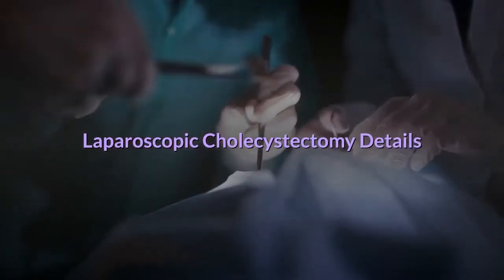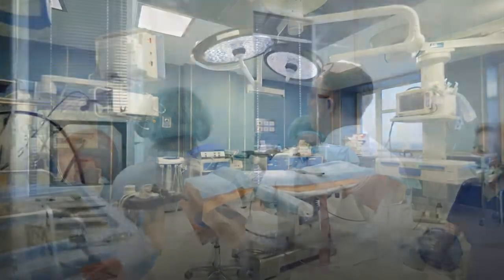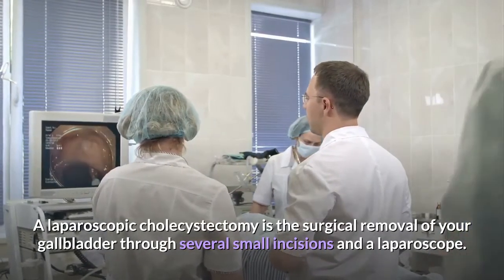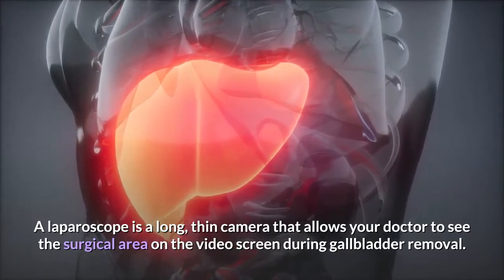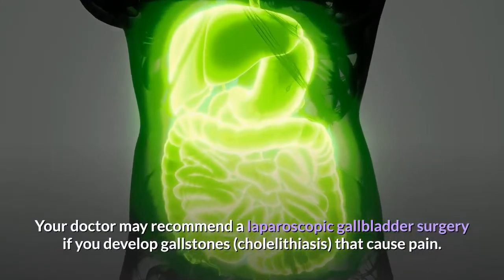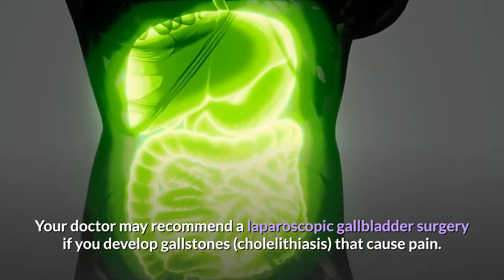Laparoscopic cholecystectomy details. What is a laparoscopic cholecystectomy? A laparoscopic cholecystectomy is the surgical removal of your gallbladder through several small incisions and a laparoscope. A laparoscope is a long, thin camera that allows your doctor to see the surgical area on the video screen during gallbladder removal. Your doctor may recommend a laparoscopic gallbladder surgery if you develop gallstones, cholelithiasis, that cause pain.